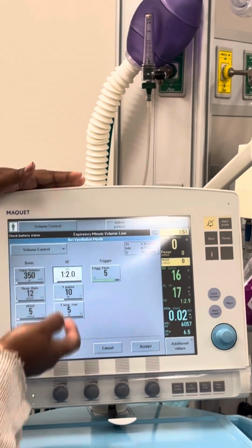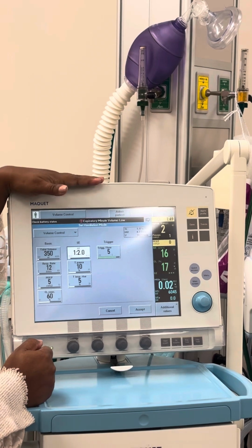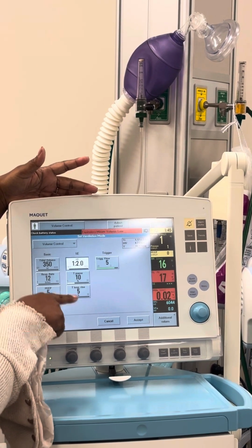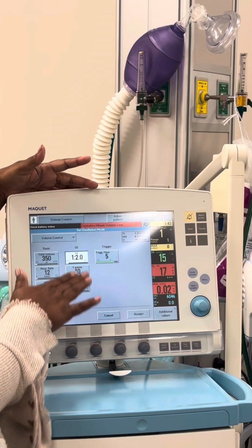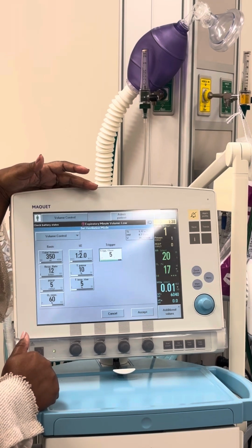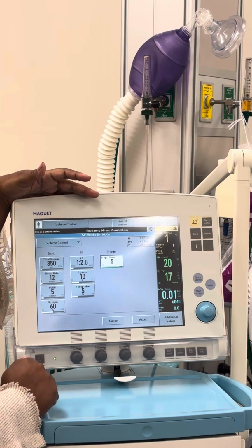All right? This one will let you adjust the IE ratio here. We're going to keep an average of 1 to 2. We don't really do a pause time or inspiratory time right now, so you can kind of leave those. But what's my flow trigger? That's your flow trigger. Y'all set that over at Miss Temple. She gave you a range.